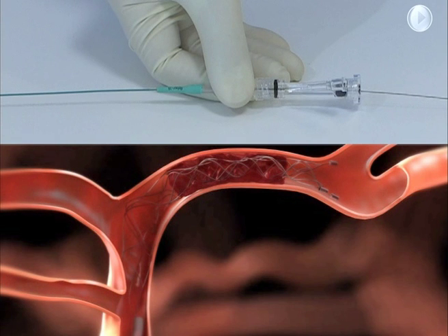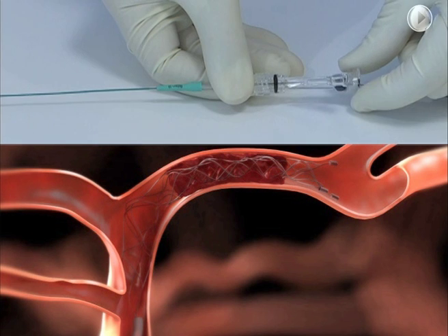The usable length of the deployed Solitaire FR should extend past each side of the thrombus. Tighten the RHV around the micro catheter.